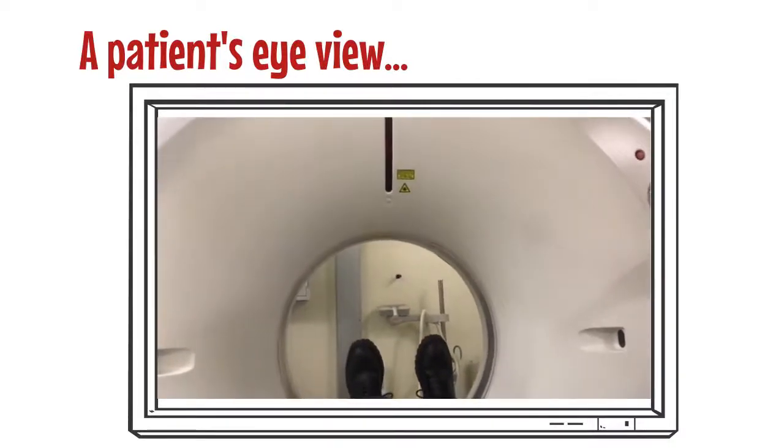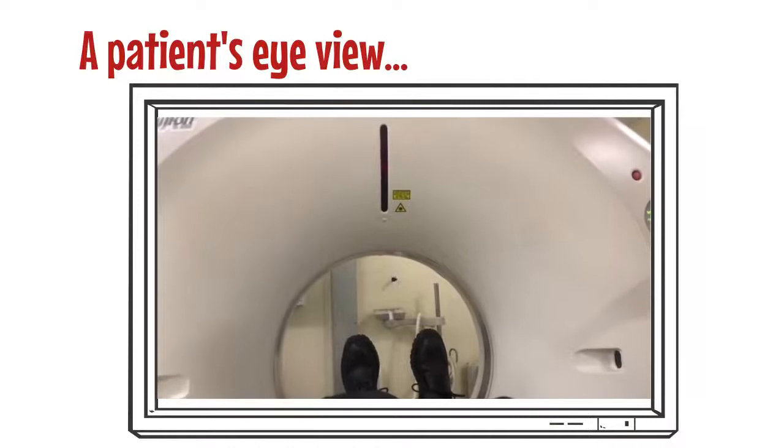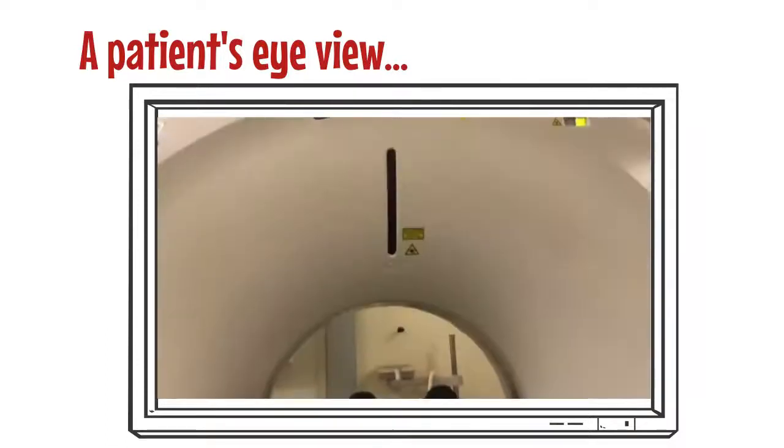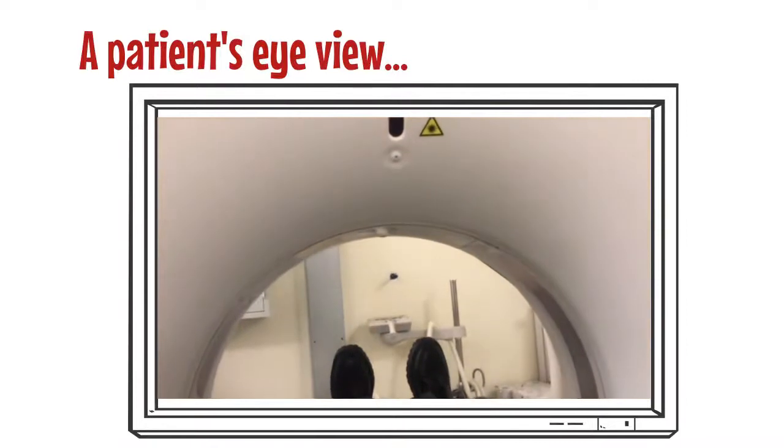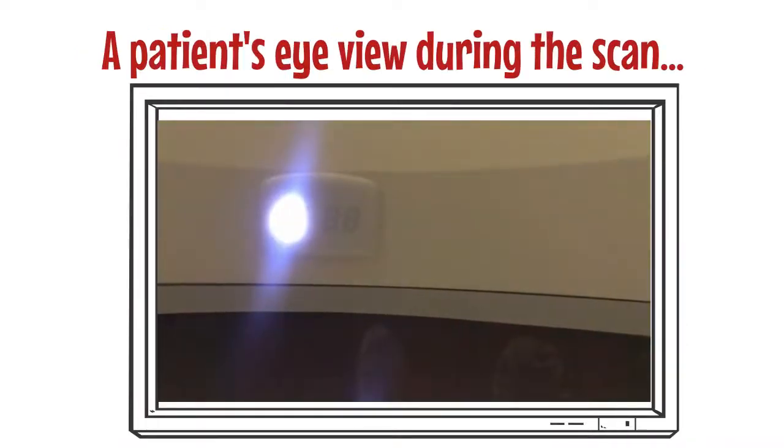The radiographer will then talk you through what is going to happen during the scan. However, during the actual scan, they will need to leave the room, though they will be able to see and hear you throughout the whole scan. Whilst appointment time is usually between 10 and 30 minutes, sometimes 90 if you need to drink before your scan, the actual scan is very short.